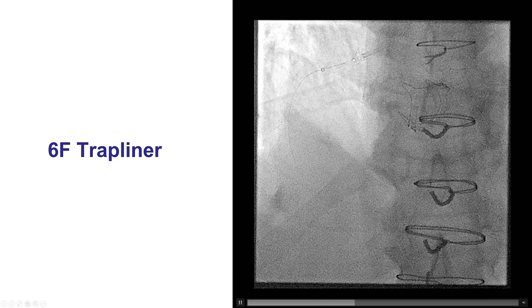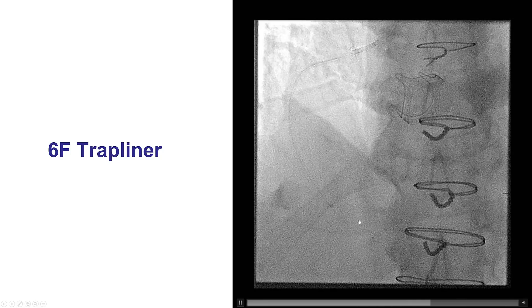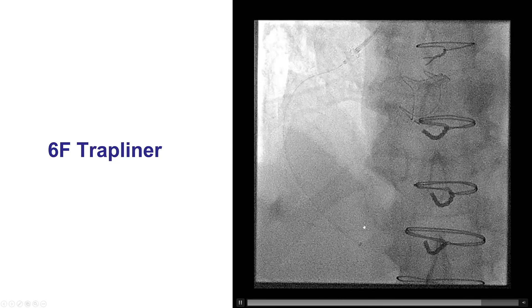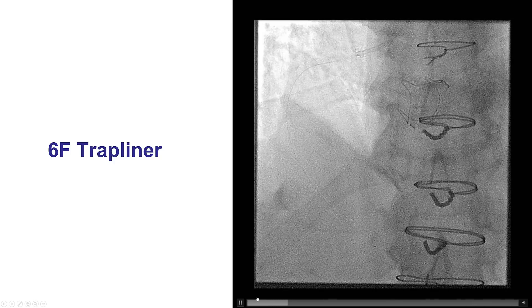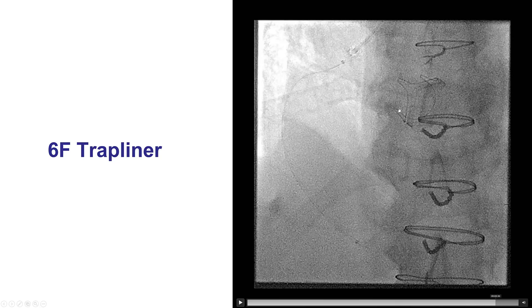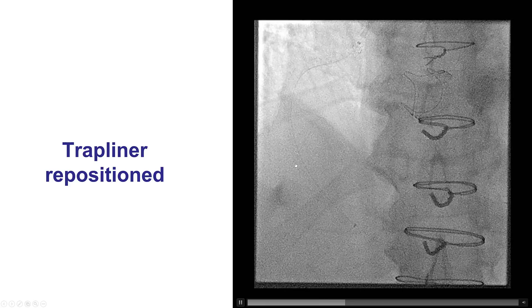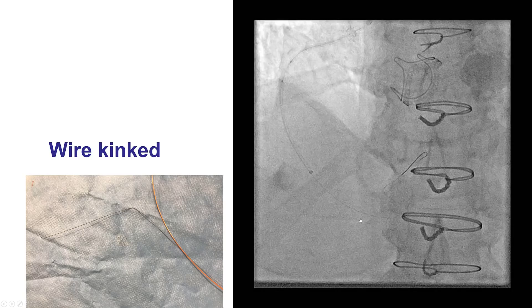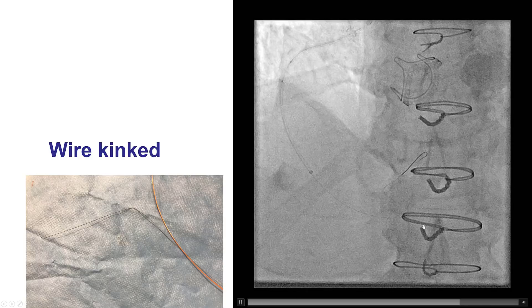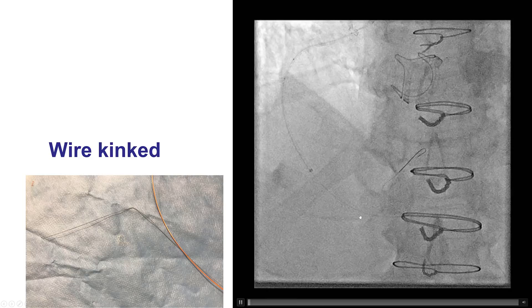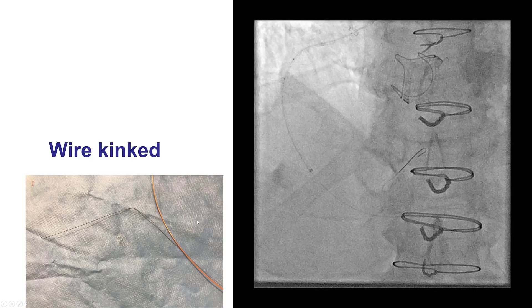Given the delivery difficulty, we decided to re-advance the TrapLiner. The limitation of the TrapLiner versus the GuideLiner is visible here — it is 13 centimeters long, and by being relatively short, it went completely out from the guide catheter, creating a gap between the guide catheter tip and the guide extension entrance. We pulled it back, and that provided enough support for delivering equipment. However, during attempts to deliver the stent again, the wire prolapsed into the PDA with a large kink, and this is how the wire looked after it came out.